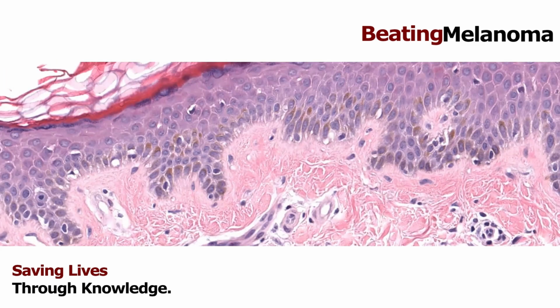So melanocytes' job is to create melanin pigment, and that melanin is what gives our skin its color. It helps protect the skin from ultraviolet light to some extent. The melanin is made by melanocytes, but is actually mostly stored in the neighboring keratinocytes. It makes like a little protective umbrella for them to keep over their nucleus to keep the solar rays out.